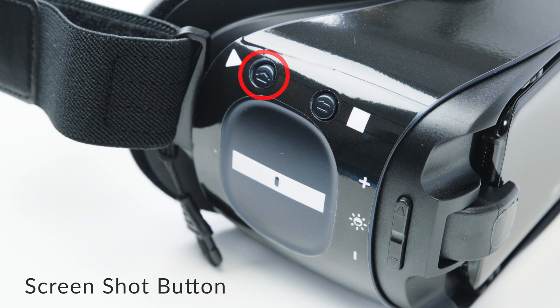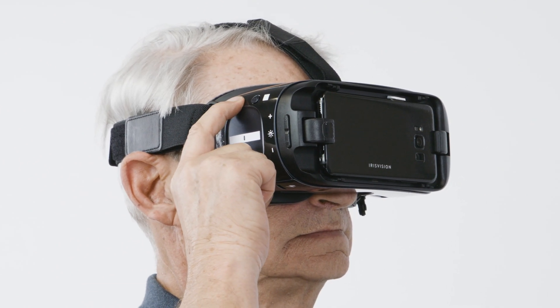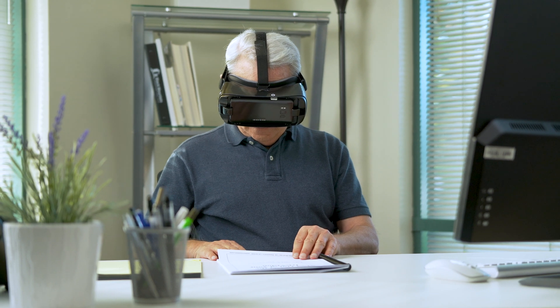Here is the screenshot button. This is the other button at the top right of the headset, closest to your right ear. Use this button in order to take a still photo of reading material or people in places.